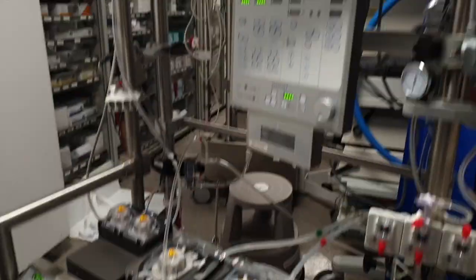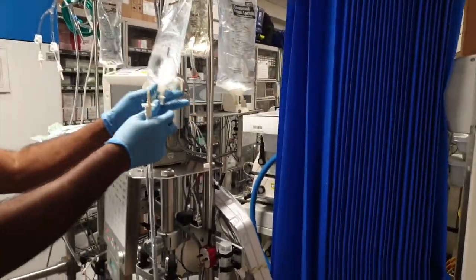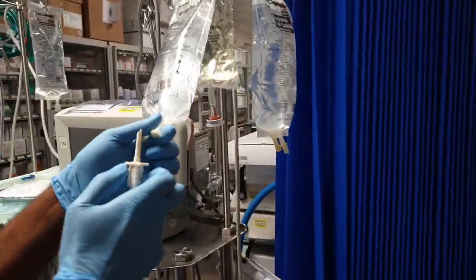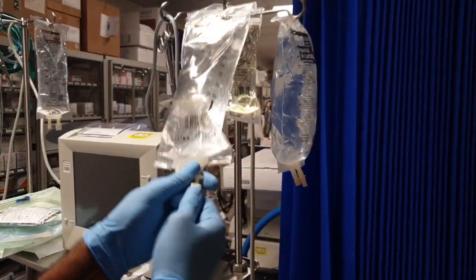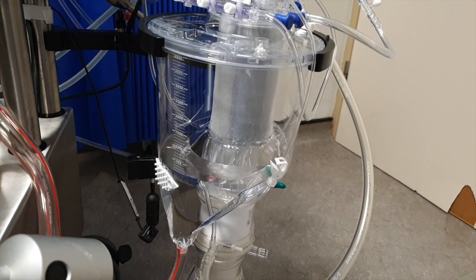With these solutions we also add a small amount of heparin, which is an anticoagulant — in other words, it's a blood-thinning drug — to coat the tubing.